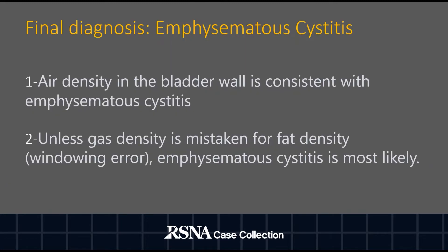The final diagnosis in this case is emphysematous cystitis. Air density in the bladder wall is consistent with emphysematous cystitis, and unless gas density is mistaken for fat density due to windowing error, emphysematous cystitis is the most likely diagnosis.